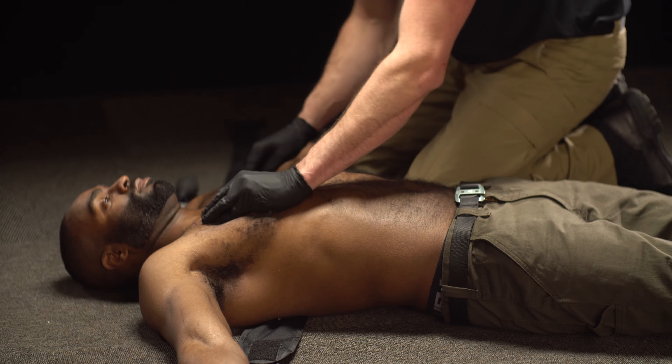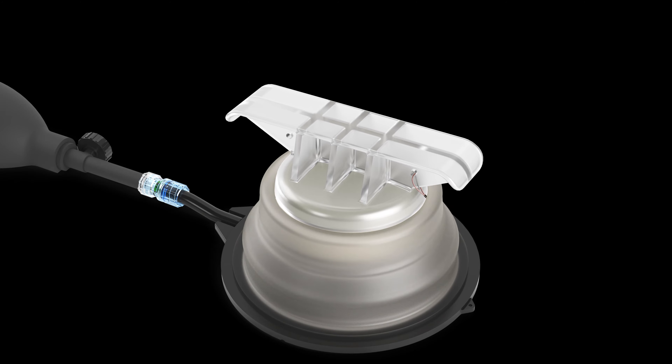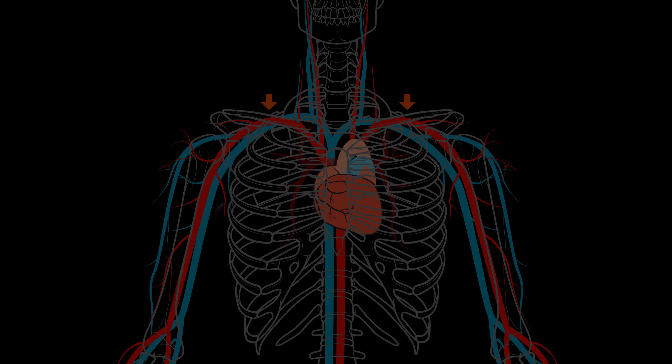Because the subclavian artery lies deep, a special TCD extender is used to contact and apply pressure to the subclavian artery as it exits from beneath the clavicle.